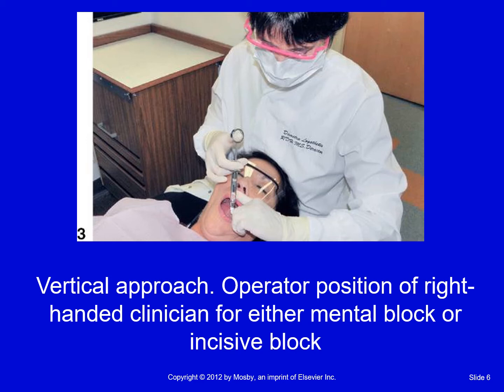And so you can give it behind, or you can give it from the side and approach it from coming inside. I think it's far easier to give it when you're sitting at the 12 o'clock position. If you guys think it's easier for you to give it from a front position, you can do that, but most everybody likes giving it from the back. You have a good visual, and the only thing is the patient obviously can see the syringe, so you might want to have them close their eyes if they're a little squeamish.